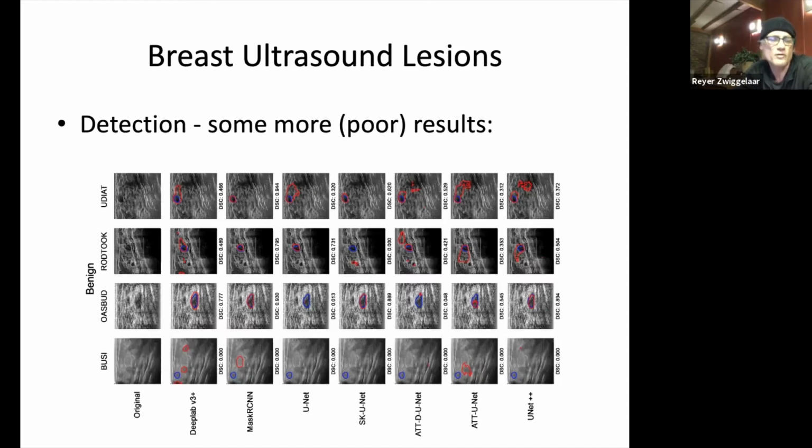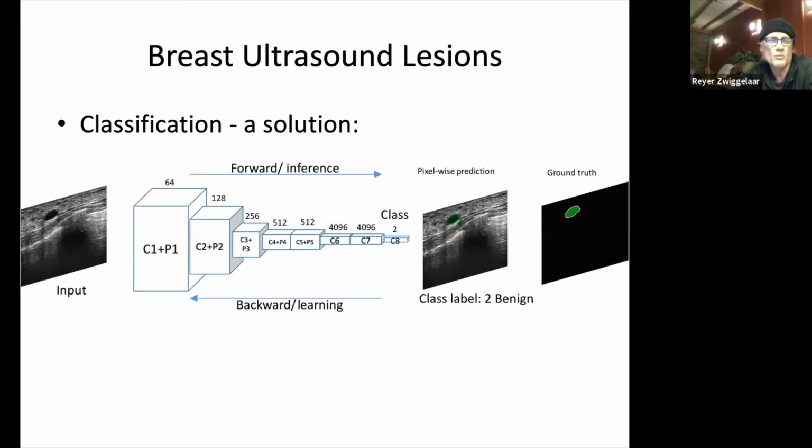That's detection. That's actually identifying where the lesions are in the image, but we actually also want to do classification. And some of the classification is really simple. We can plonk a whole image into a deep learning framework and have ground truth at the end, and that will give us some results there. We've been doing that over the last couple of years, but also very recently.